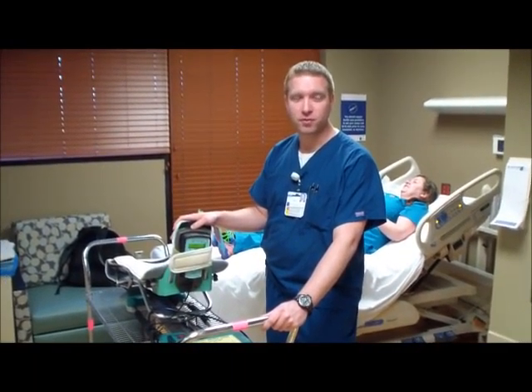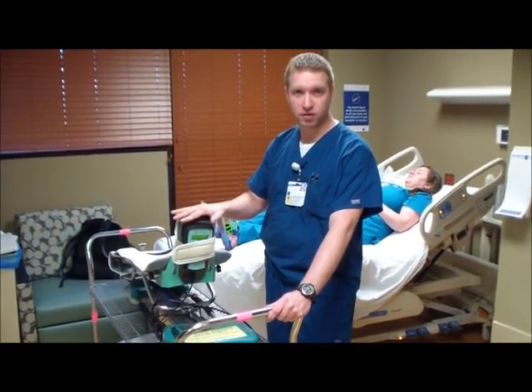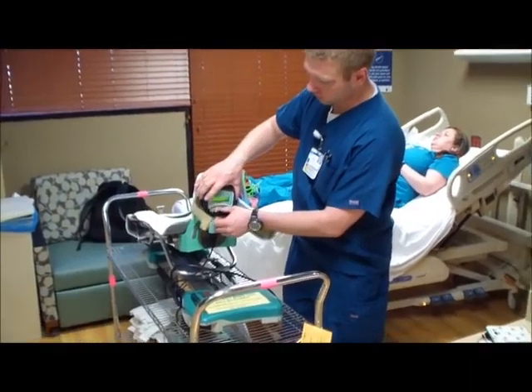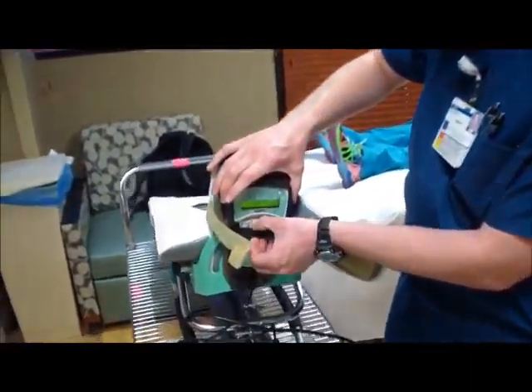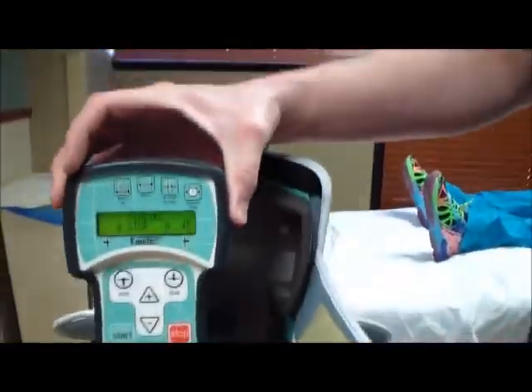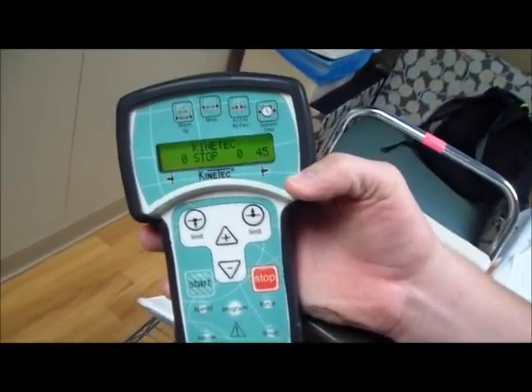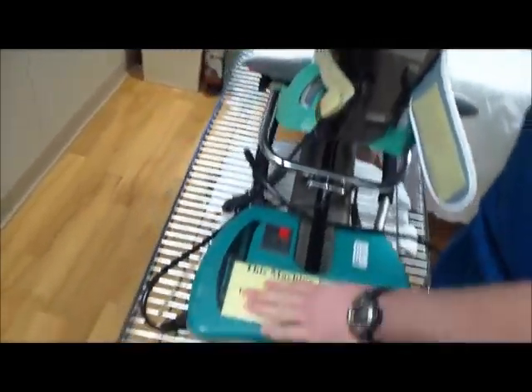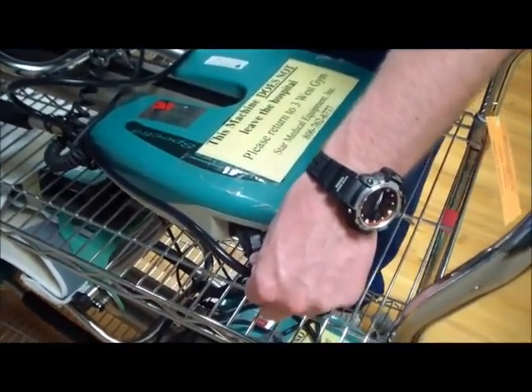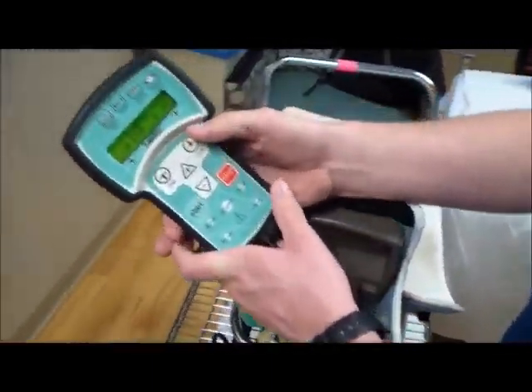Then you want to make sure you place the proper settings on the computer itself, attached to the end part of the CPM, so it'll be secured in place. So we can take it out from the little station it's got here. You want to make sure it's on. If it's not turning on, you want to make sure you check all your connections, where it inserts into the CPM itself, and make sure it's plugged in as well.